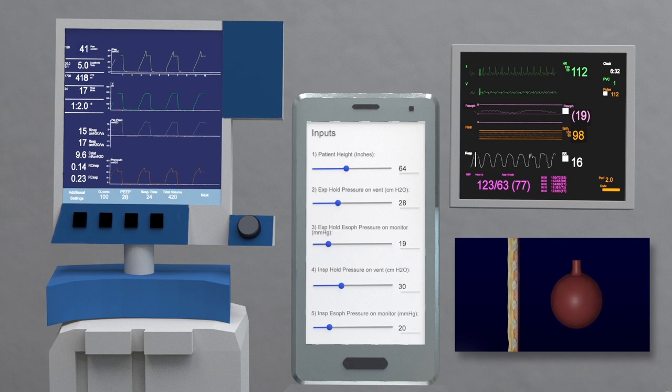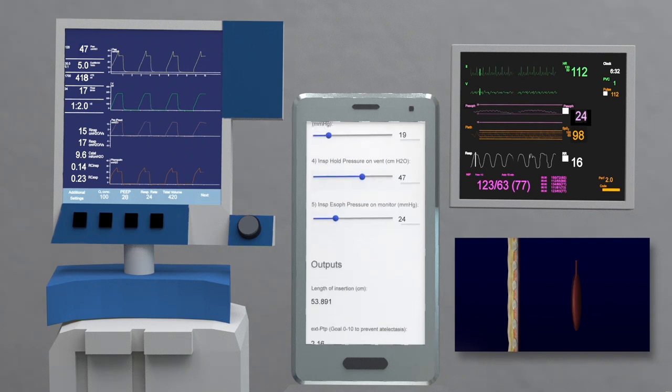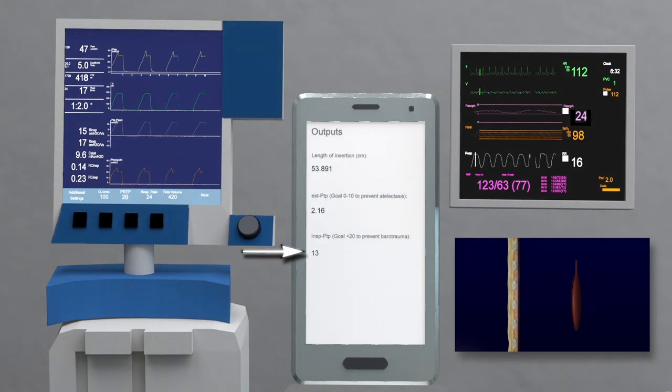Then let's determine if this PEEP is safe by checking the transpulmonary plateau pressure at end inspiration. Press the INSP hold button and set slider 4 to the end inspiratory pressure shown on the ventilator and slider 5 to the esophageal pressure shown on the bedside monitor. Make sure the end inspiratory transpulmonary pressure is less than 20.